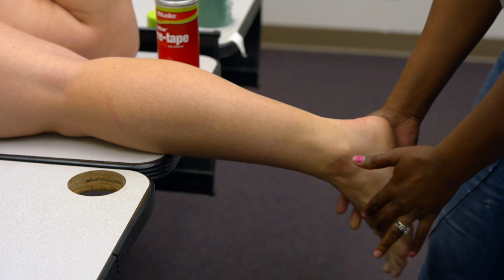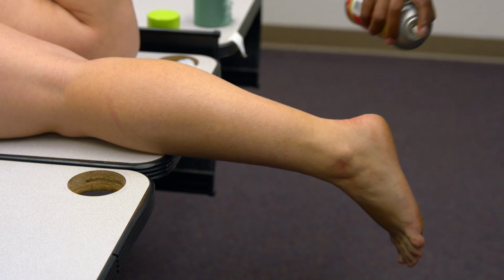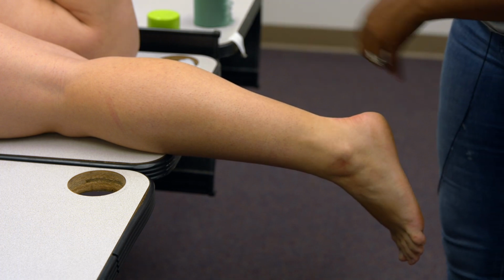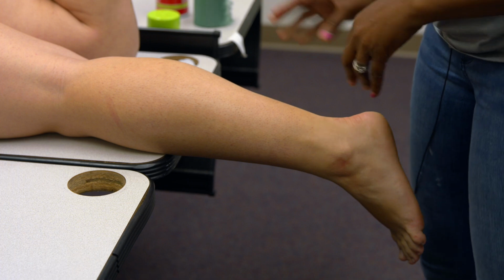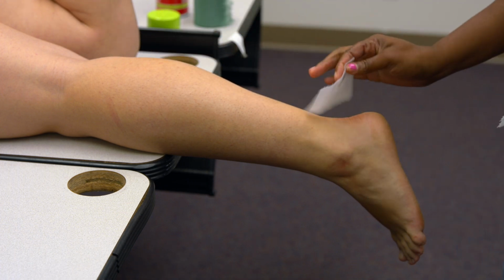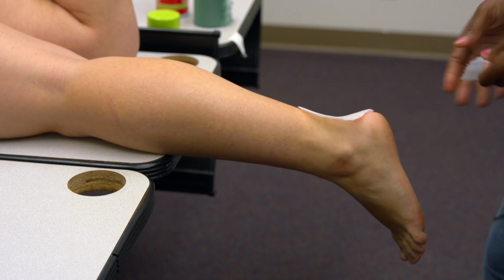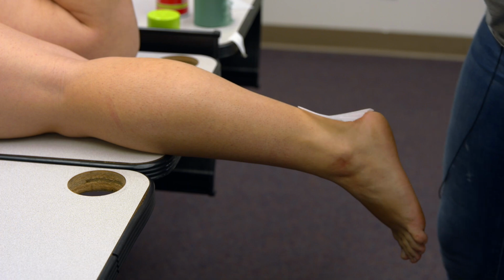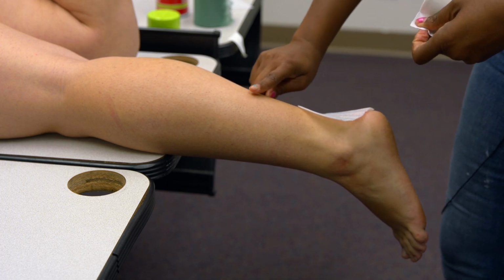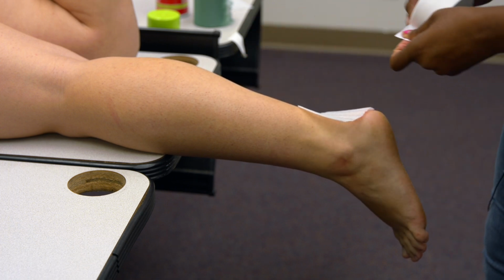So just like with every great tape job, the Achilles tendon is going to start with spraying the patient down with the tough skin to make sure that the skin is sticky and the tape can adhere to the patient. We are going to use a heel and lace pad, but this time around, it's just going to go over that Achilles tendon. And so as we begin our tape job, we are going to begin with 2 proximal anchor strips, and then we'll go distal and we'll move into the 2 distal anchor strips.